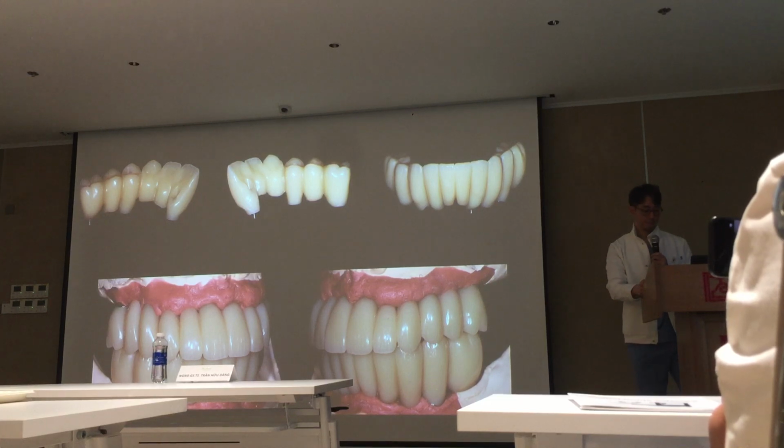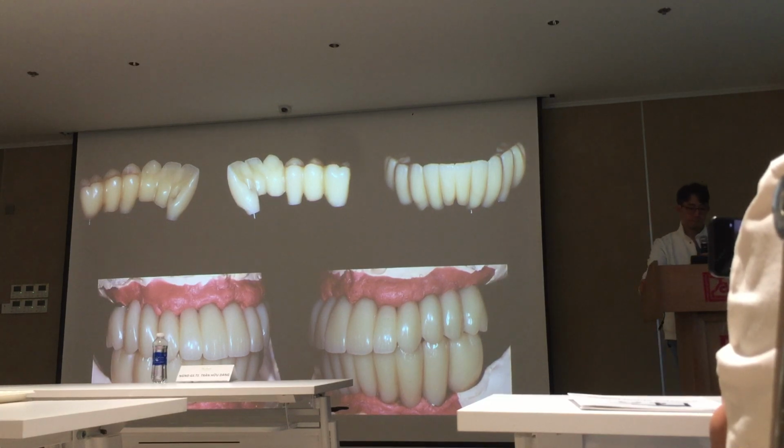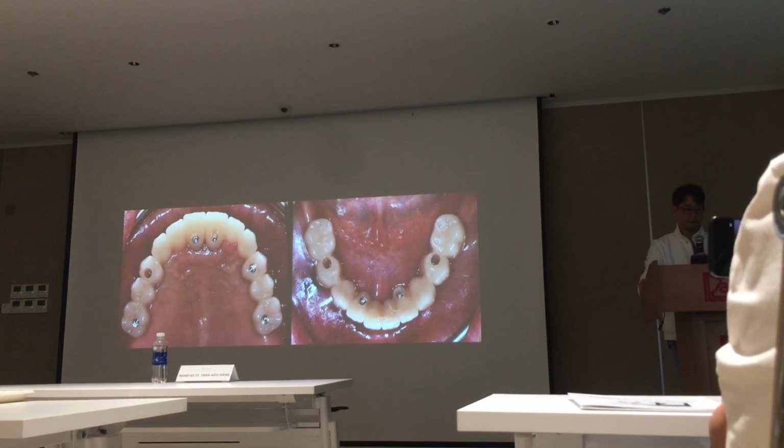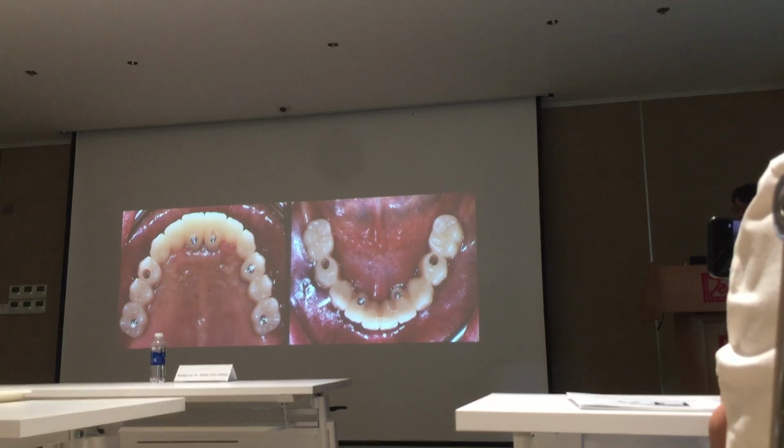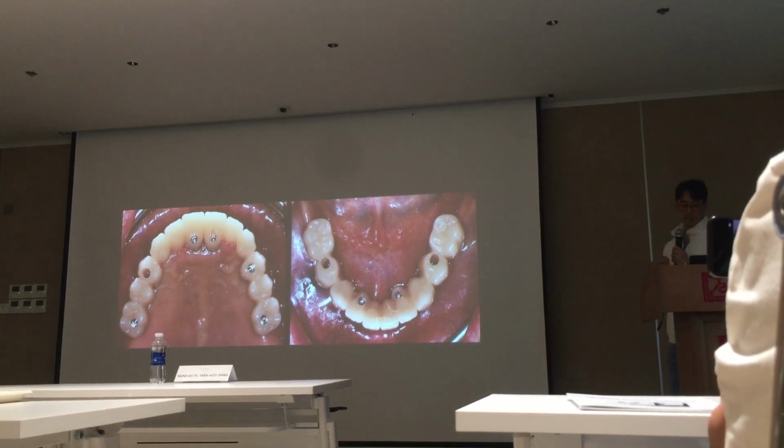Nicely made prosthesis was delivered to the patient and the result was very good. So after verifying occlusion, function, and aesthetics, I decided to move on to the final definitive restoration.